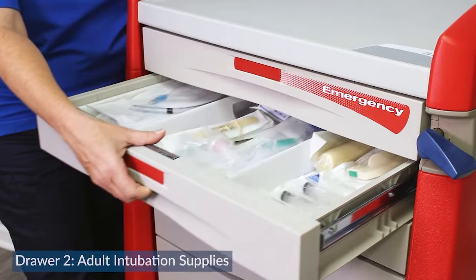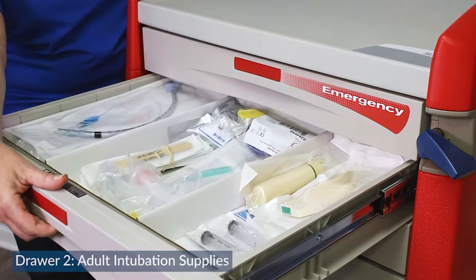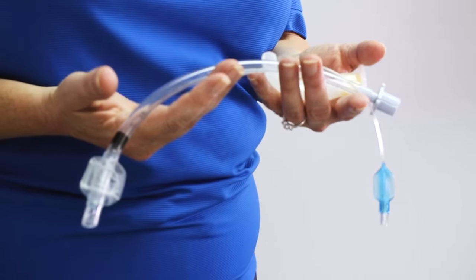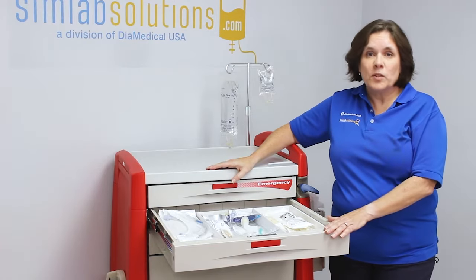The second drawer contains all of our adult intubation and airway supplies. These are used in an emergency to help patients breathe when they can no longer breathe on their own.